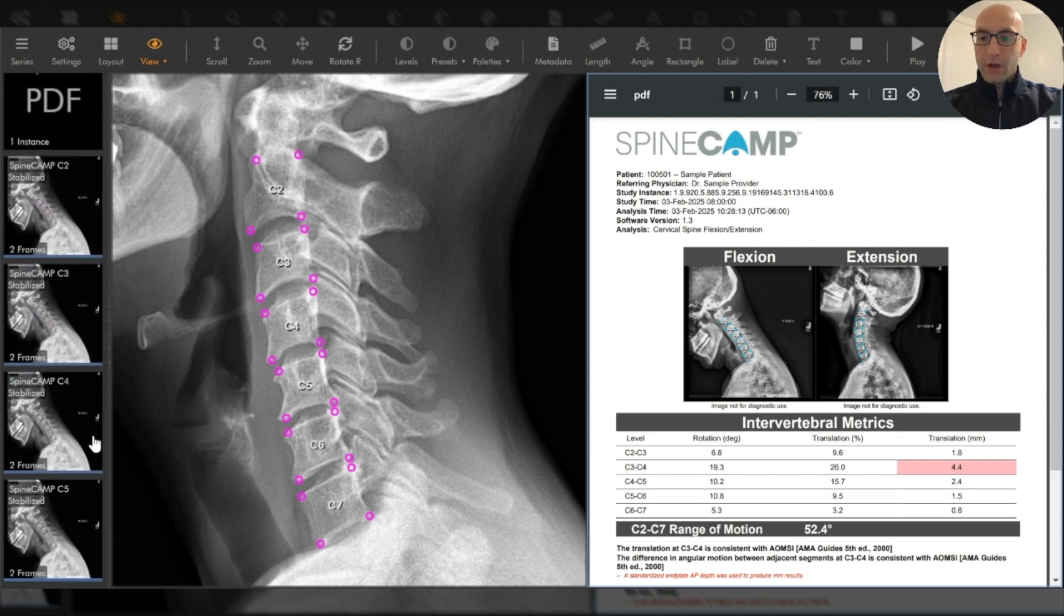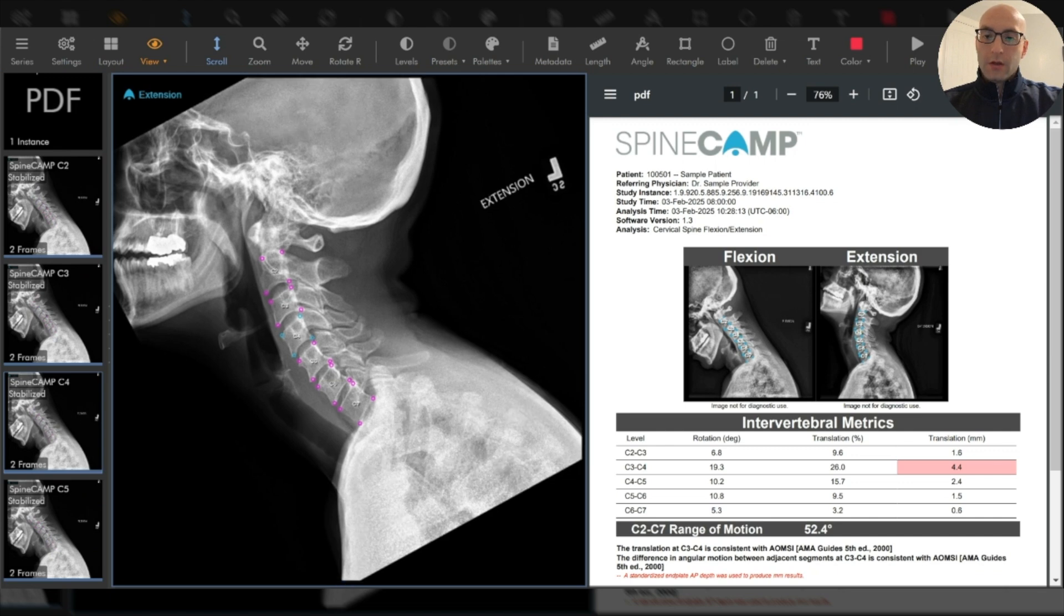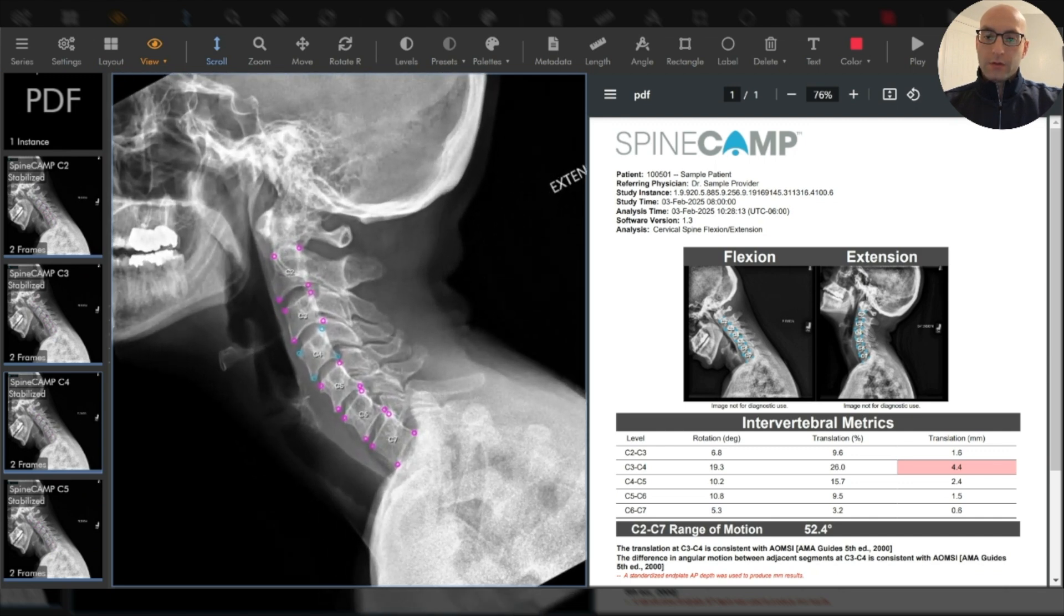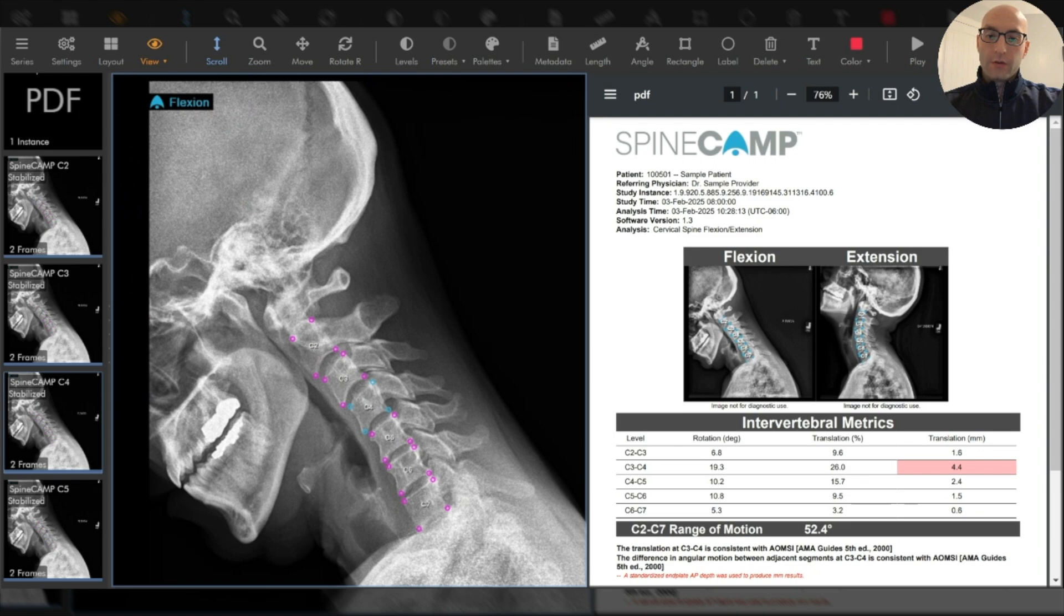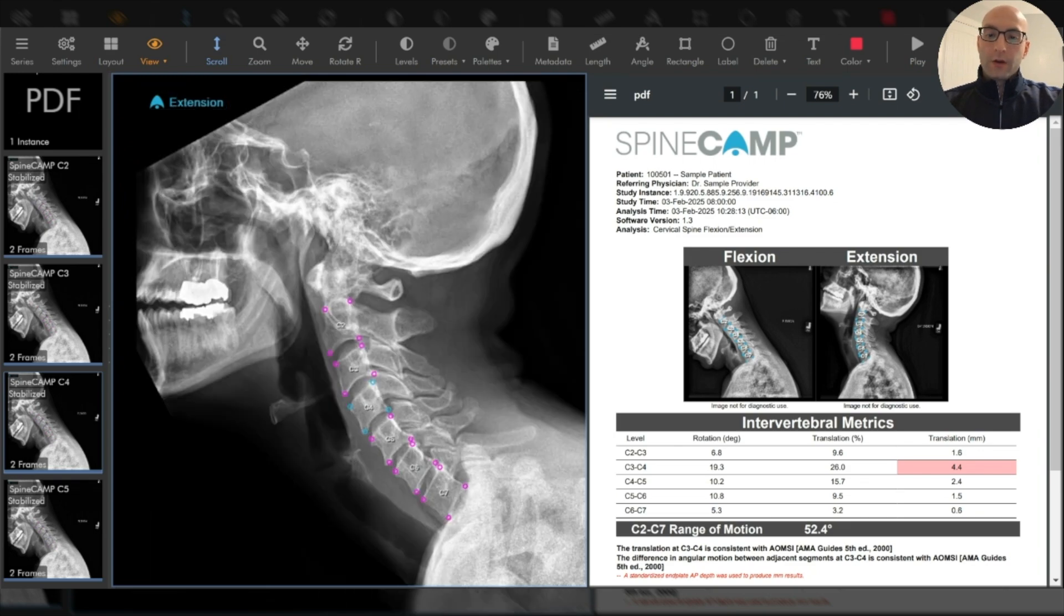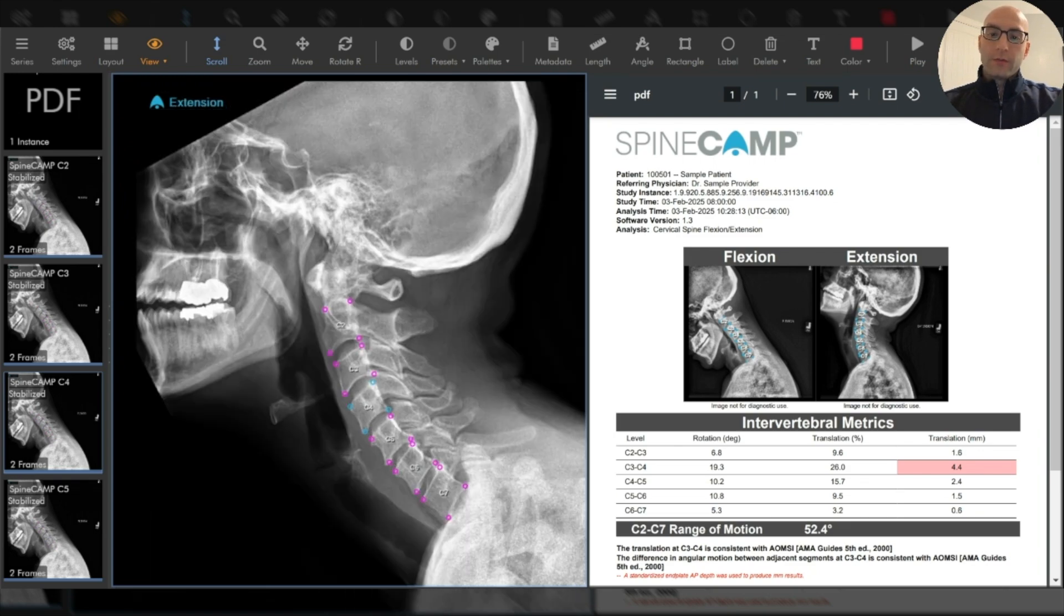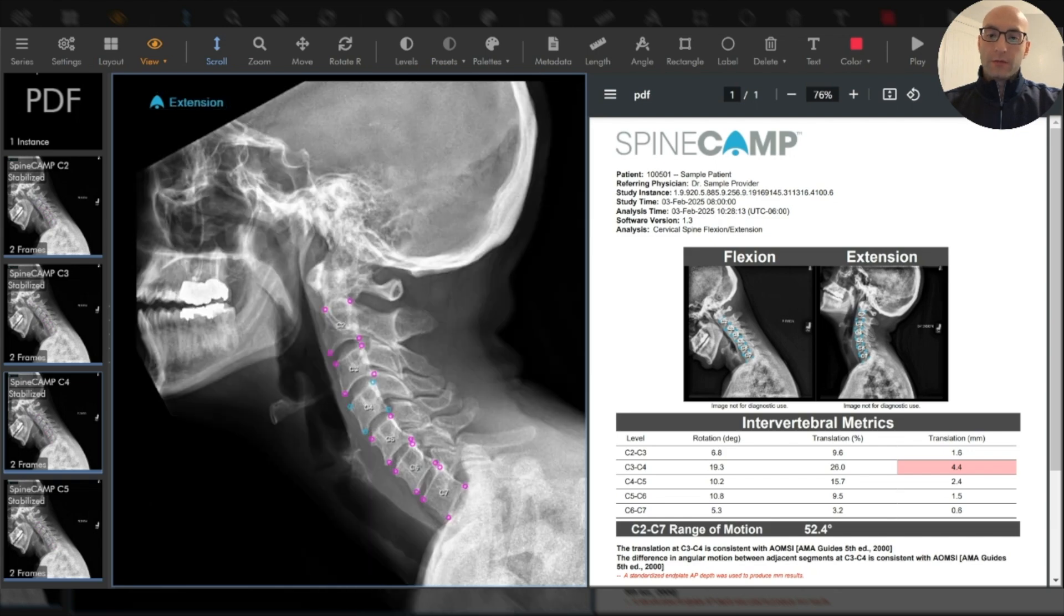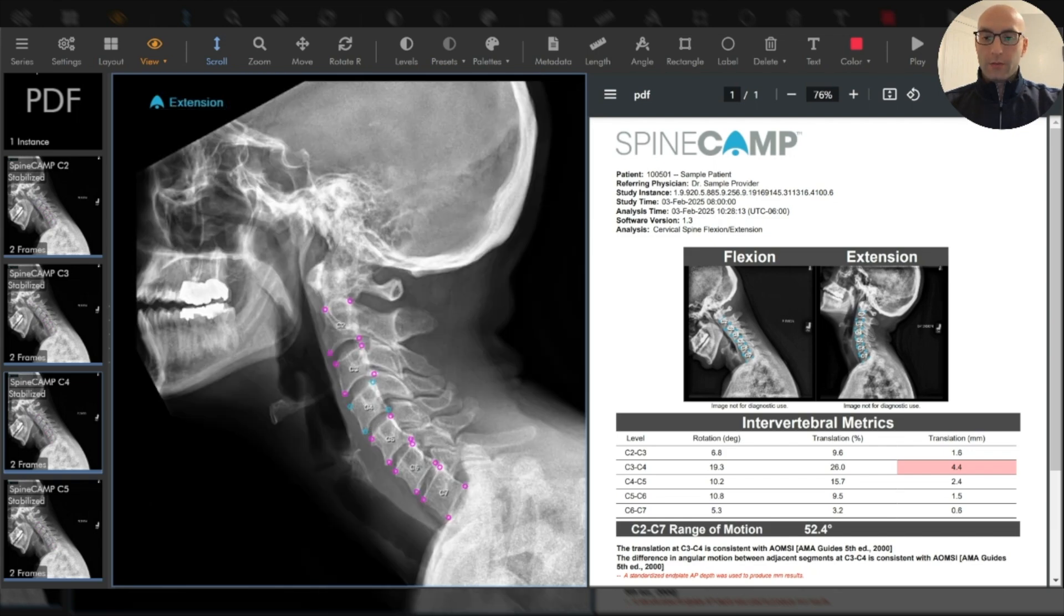That's accompanied by what we call stabilized imaging. This stabilized imaging is an extremely powerful visualization where vertebral body is registered between flexion and extension. As you can see here, the C4 vertebral body is frozen in place while I flip back and forth with my mouse wheel.